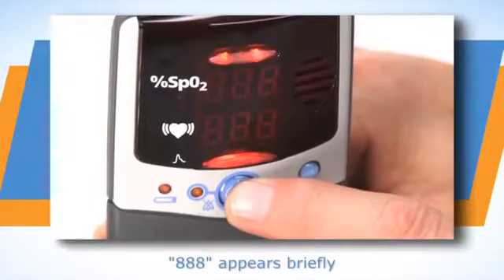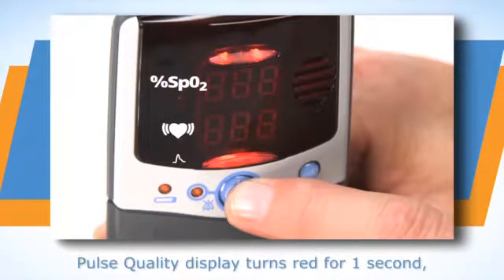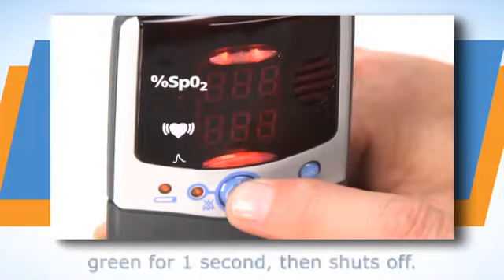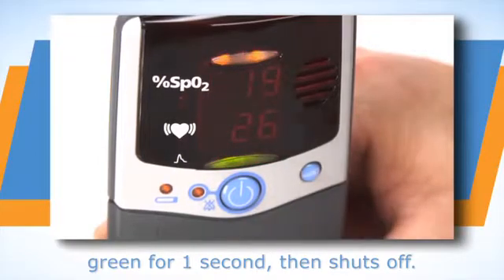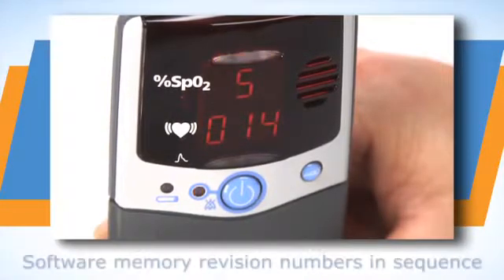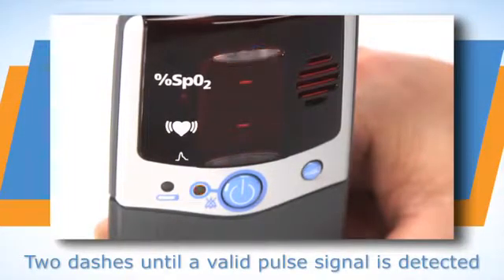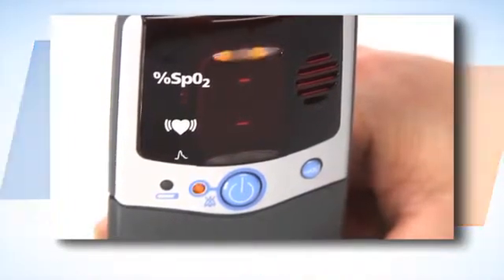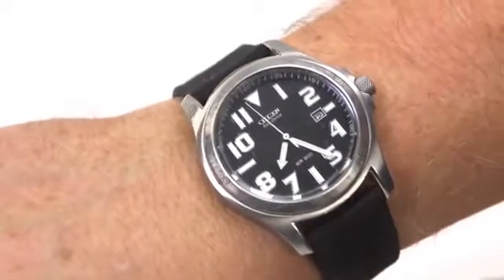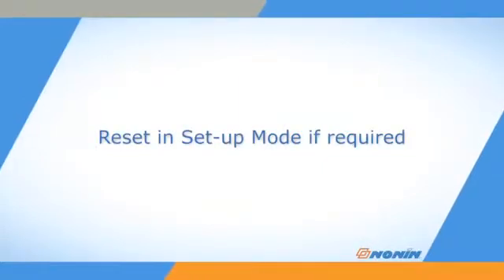Press the on-off button to start the unit. The oximeter will run through a power-up systems check as it turns on. Watch the systems check to ensure all the LED elements and information appears as shown here. If any LED elements or displays do not appear as expected, remove the unit from use and return for service or repair. Check the oximeter's time and date settings for accuracy during startup, and reset the oximeter in setup mode if they are not accurate or appear as zeros.